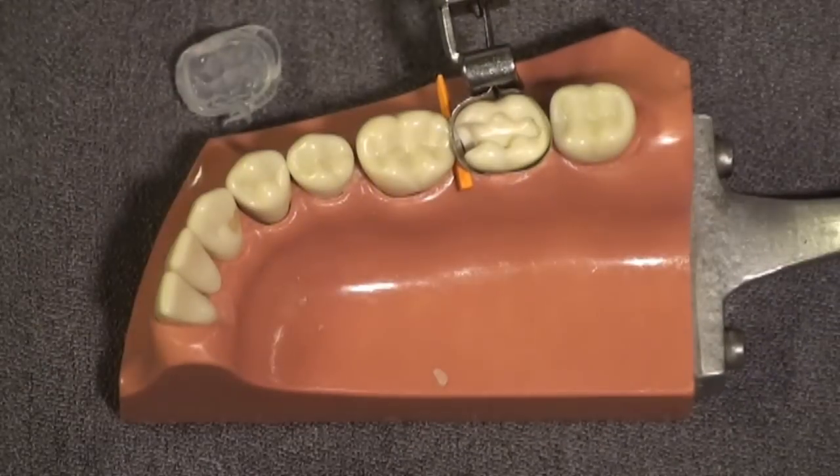I'm doing this with a Toffelmeyer matrix band. The same thing can be done with a sectional matrix if you take your custom matrix impression adjacent to the sectional matrix earlier in the procedure.